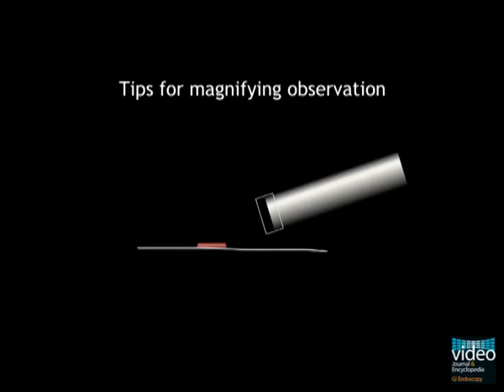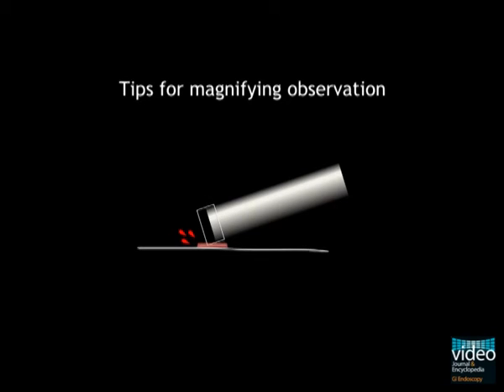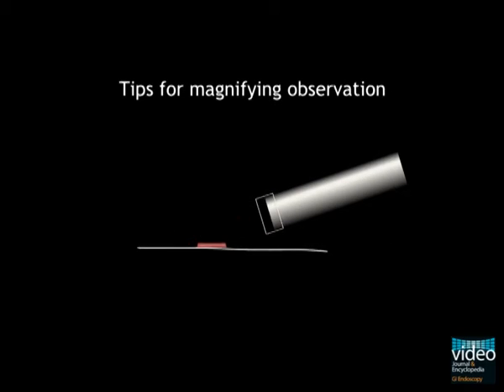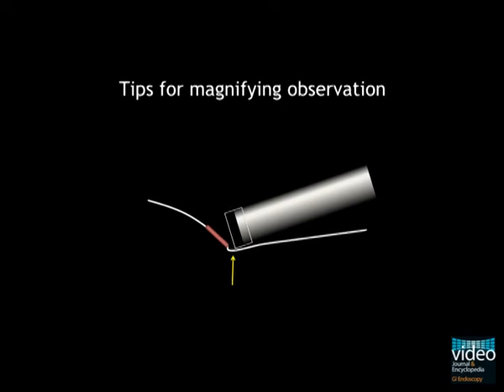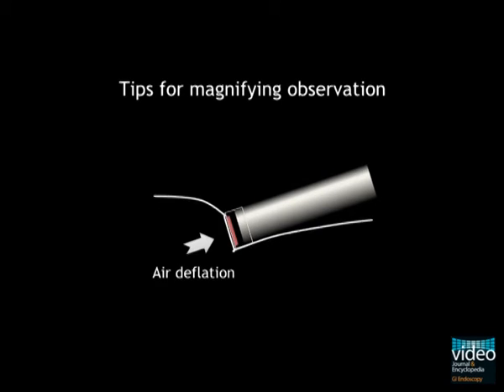To perform magnifying observation, get close to the object. When too much air is inflated, mucosa is extended and flattens, so it can be slippery and can cause contact bleeding. Put the tip of the cap on the proximal mucosa to the lesion and deflate the air to make the mucosa soften and to get close to the lesion.